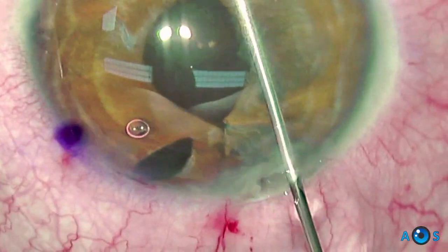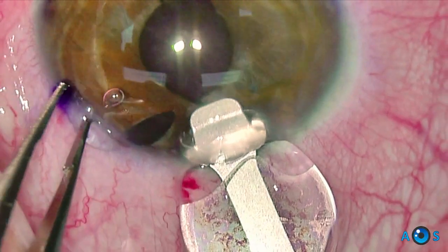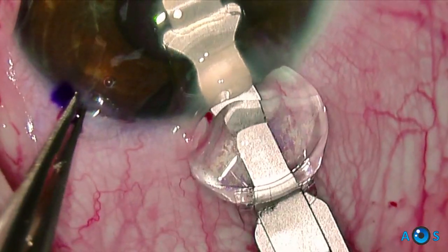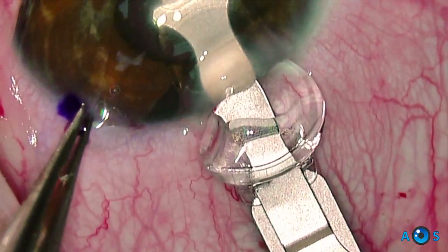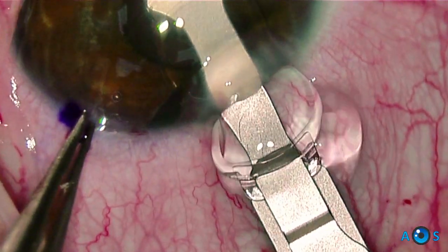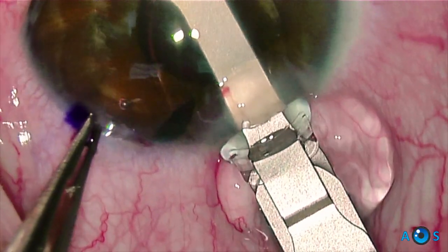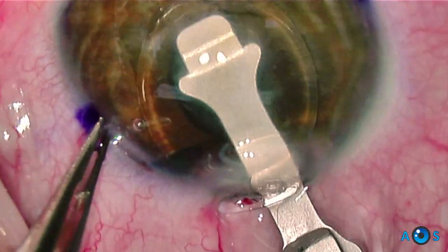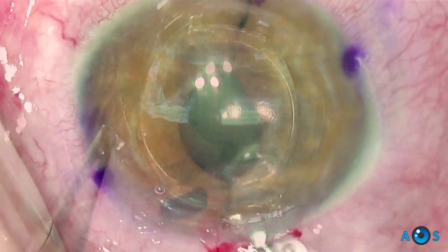Now that a centered round pupil is obtained, it is time to implant the new phacic IOL. The implantation spatula is used to introduce the IOL through the 3.2 mm incision.